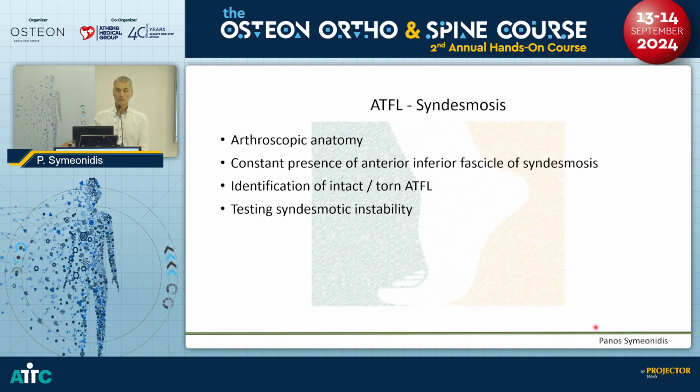So you need to be aware of the arthroscopic anatomy. The presence of the oblique ligament is constant, and it's not a pathology in most times. And you'd be able to identify the ATFL and the syndesmosis.